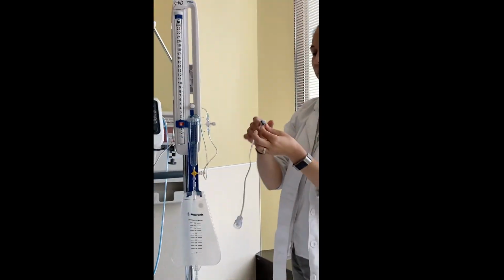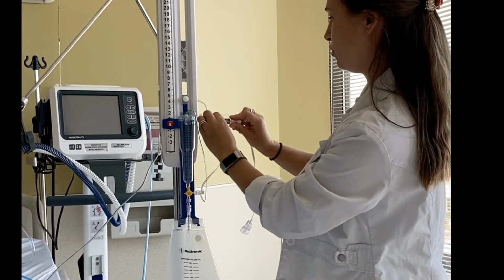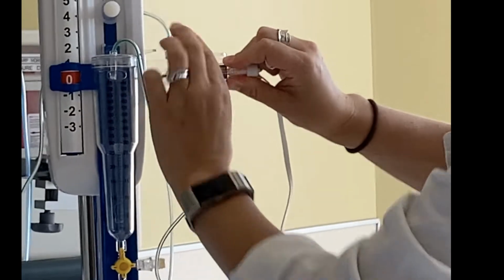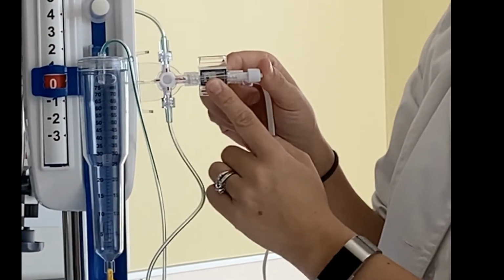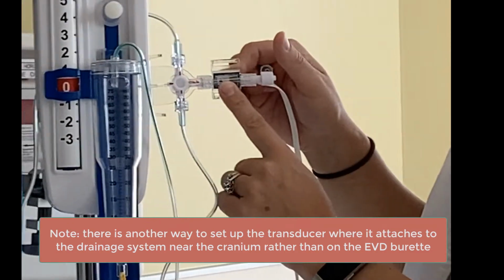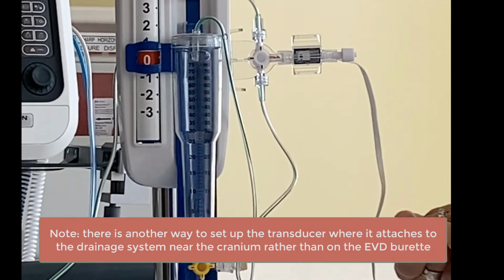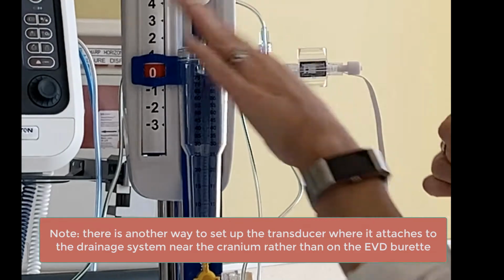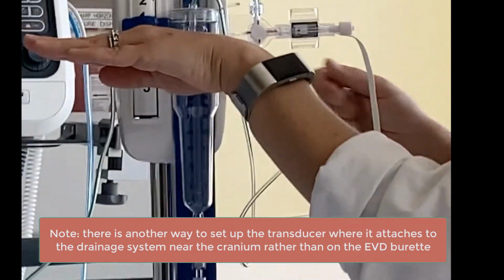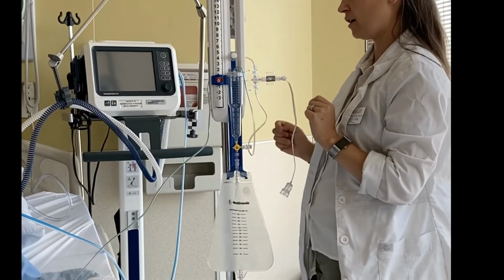How do you level it? You need your transducer. The transducer will be attached here, like so. And this black dot on the transducer is the part of the system that you level to your patient's tragus. So different hospitals and different institutions will have different ways to level this. Some of them will have a little laser pointer aligned on their EVD, and you can move it up and down to shine it to the patient's tragus.